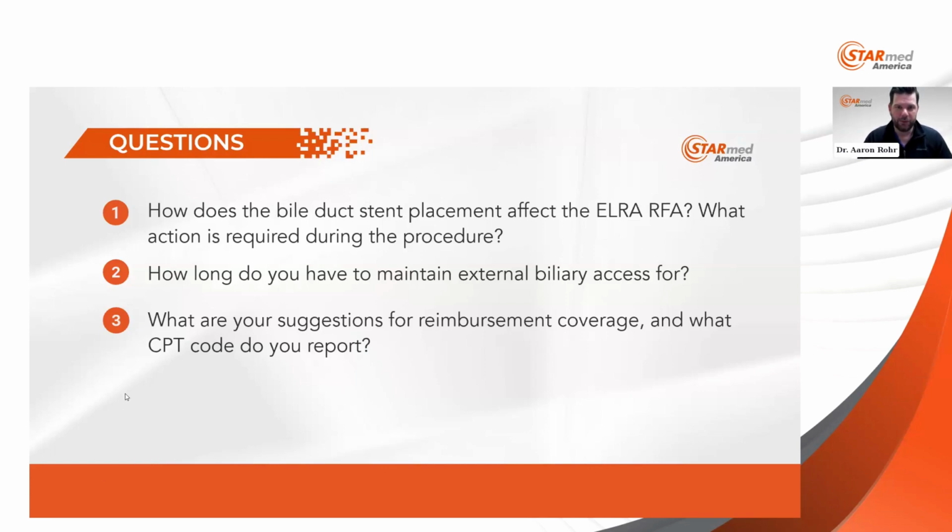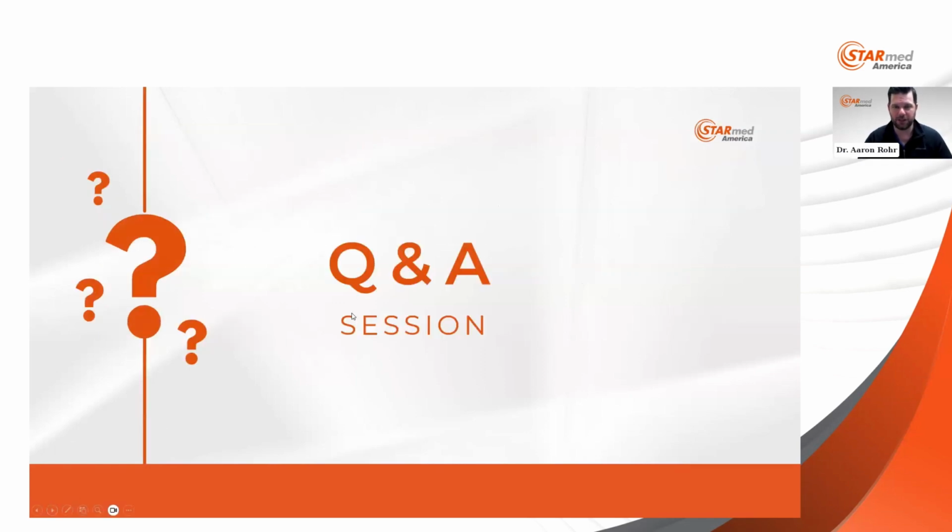Typically, we do not ablate patients that are under 4 weeks out. So whether it's immediate or long-term, as far as the complications, that kind of goes hand in hand. I don't want to ablate anything that's going to compromise that anastomosis. So that goes right into complications. I don't see a whole lot of complications. Knock on wood, I have not had any.